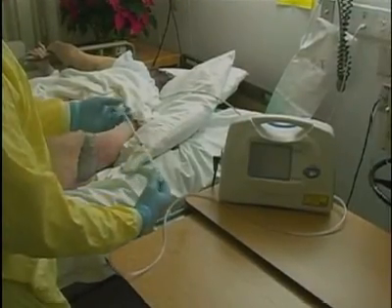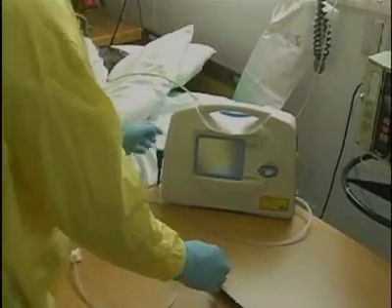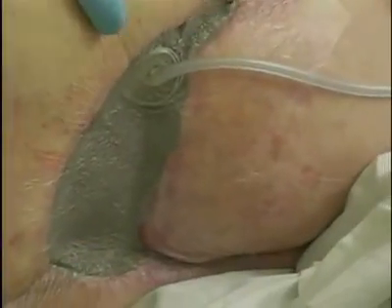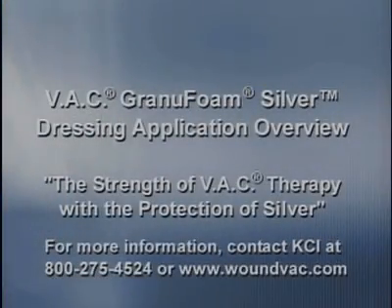Connect the dressing tubing to the canister tubing and make sure both clamps are open. Initiate VAC therapy. In less than 1 minute of operation, the VAC dressing should collapse unless leaks are present.